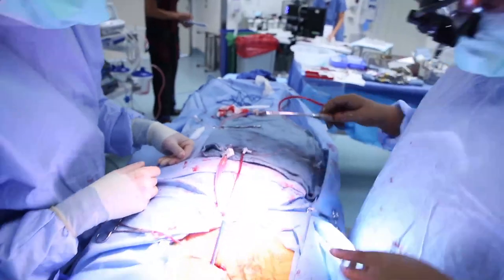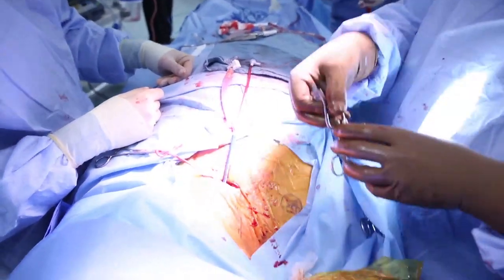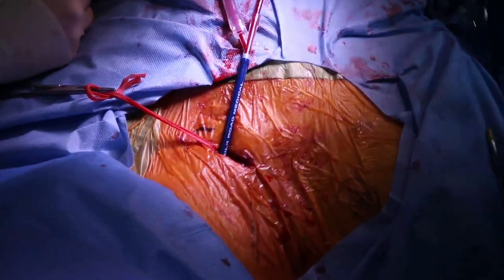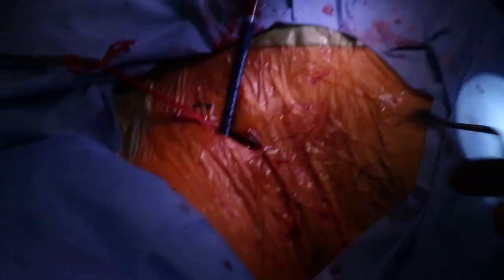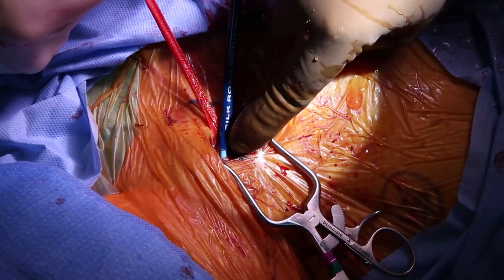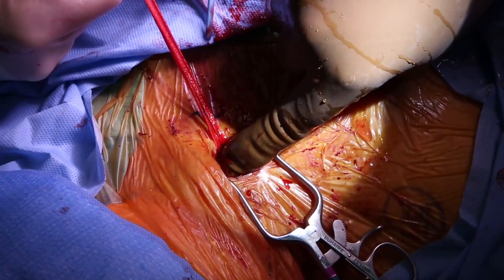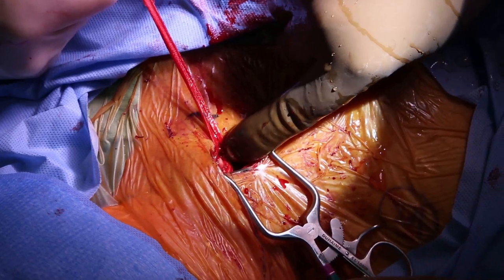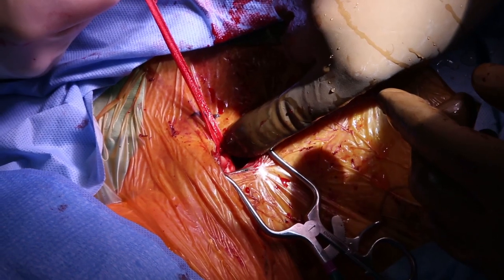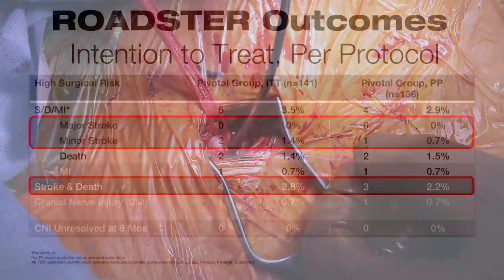The femoral venous sheath was removed and direct pressure was held. Direct visualization of the common carotid artery puncture site was obtained and removal of the arterial cannula was performed, with securing of the puncture site using the previously placed 5.0 prolene U-stitch. Hemostasis was confirmed and a 20 mg reversal protamine dose was given.